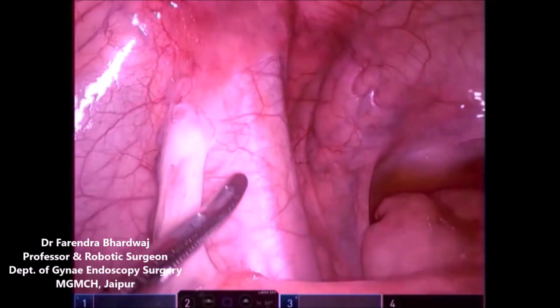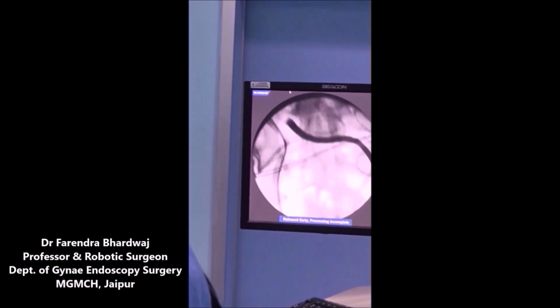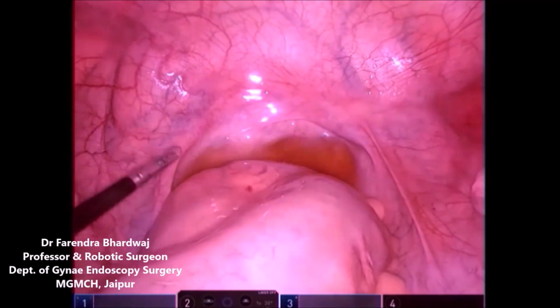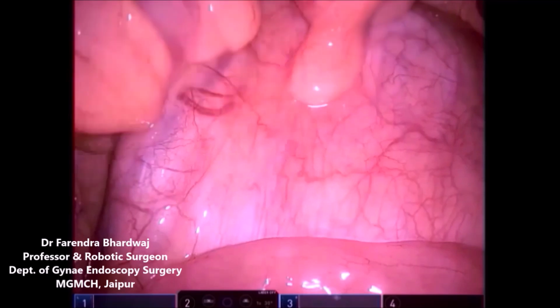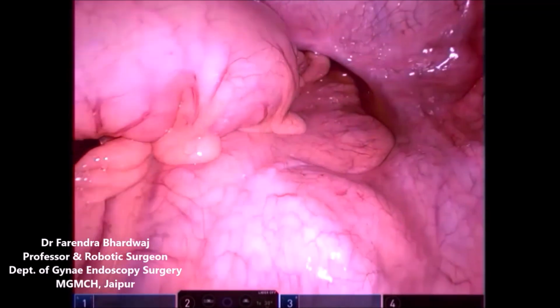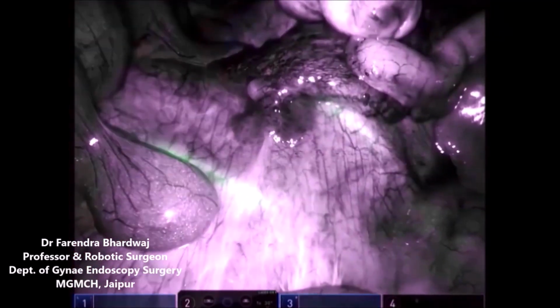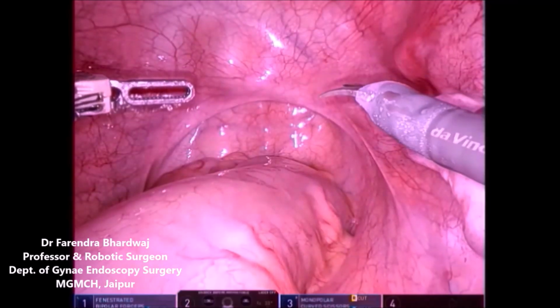On inspection we can see there is no uterus in the pelvis. Retrograde pyelography was done and ureteric stenting was done to establish the location of the ureter. Along with that, ICG dye was also injected as a help during our surgery.